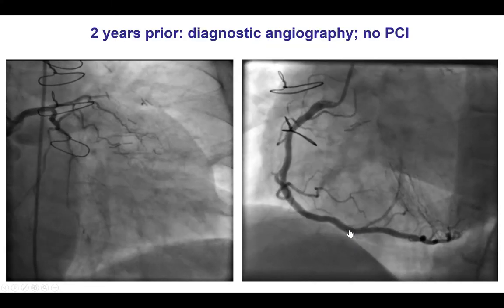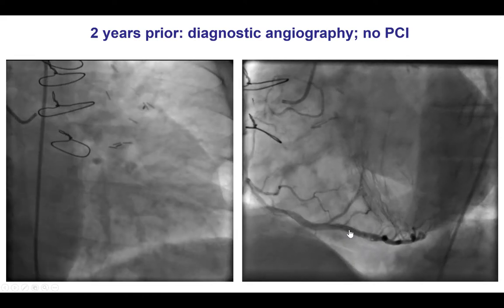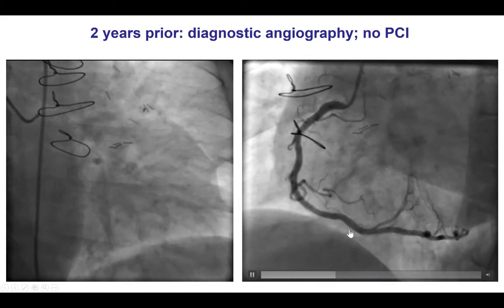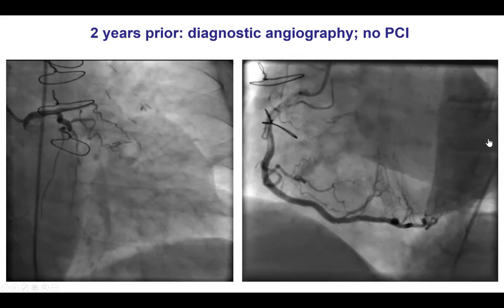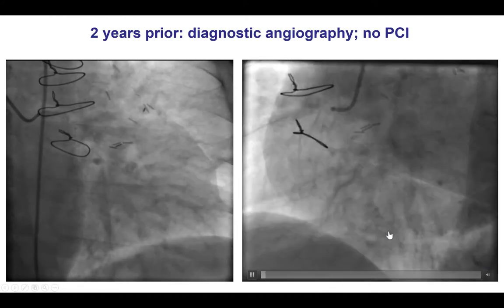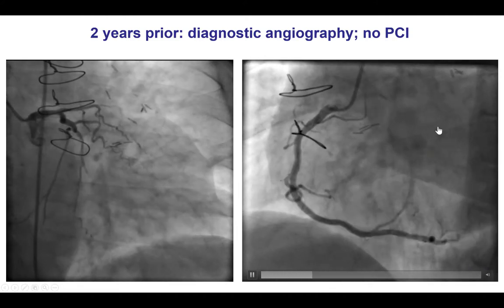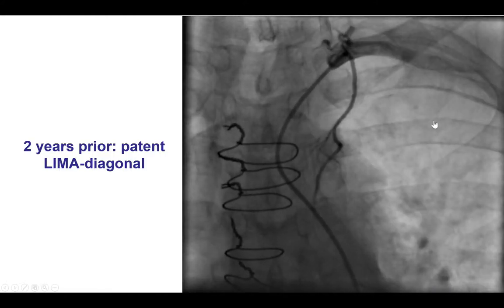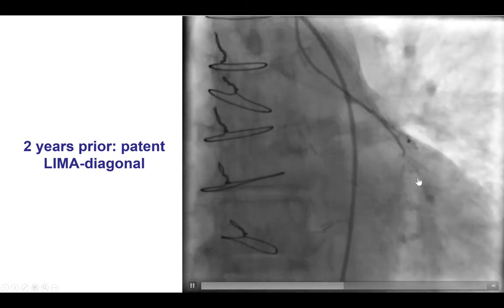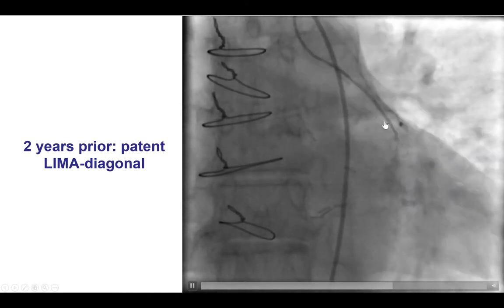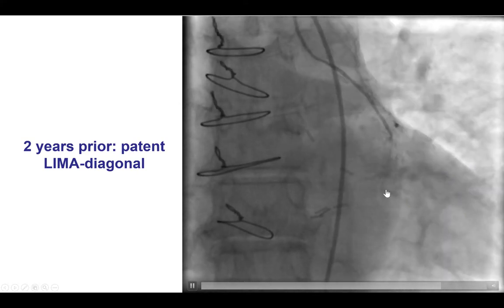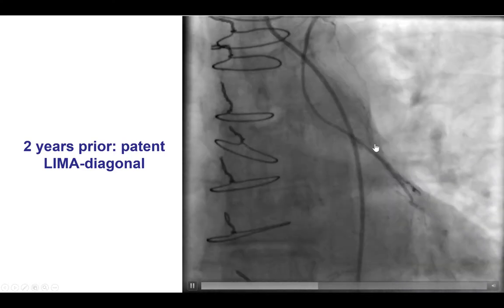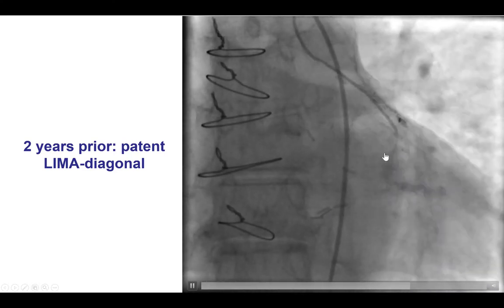Two years prior to the current presentation, he had diagnostic angiography because of angina, but no PCI was done. One can see there are some septal collaterals filling the LAD, and the LIMA seems to supply the diagonal, but we don't see anymore the retrograde filling into the LAD, suggesting some progressive disease into the LAD.